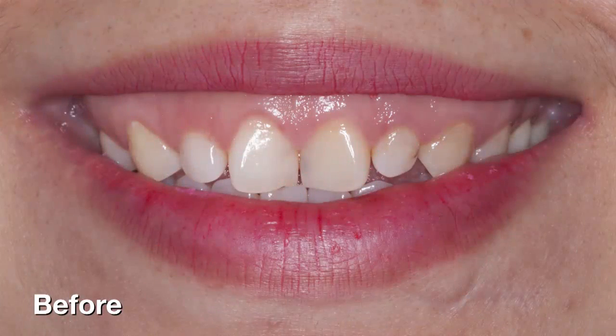In this next case, the patient was unhappy with her gummy smile, her teeth, and her facial profile. After carefully planning the solution with our in-house oral surgeon Dr. Peter Shear, her treatment included aesthetic crown lengthening by gingivectomy and ostectomy to reduce the amount of gingival display, and also genioplasty to correct her facial profile. After all options were presented, the patient also agreed to 10 prep veneers using our obsidian lithium silicate ceramic.